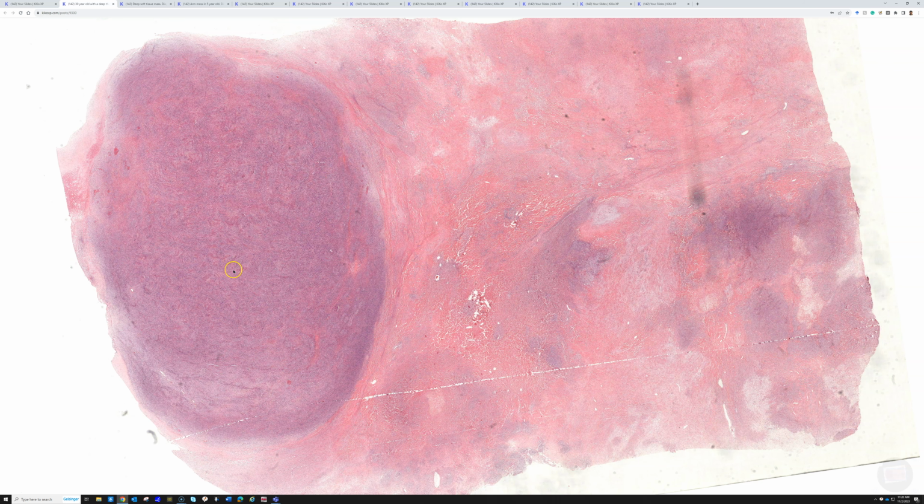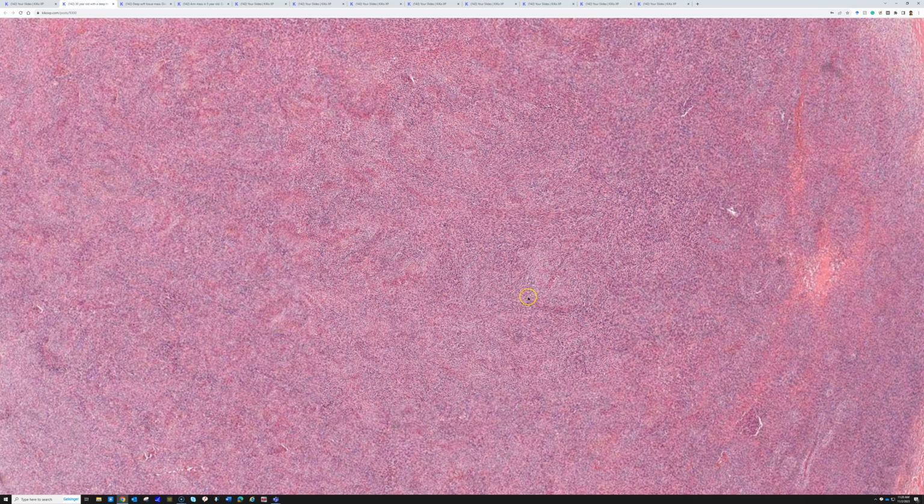So here we can see a cellular nodule in this area, and it's got kind of monotonous spindle cells with some collagen and a little bit of pale substance in the background, arranged in fascicles. Not a totally specific pattern right here, but I'll tell you what, the monotony, the lack of pleomorphism always makes me think about a translocation tumor, as you all probably know if you follow my online posts and videos.